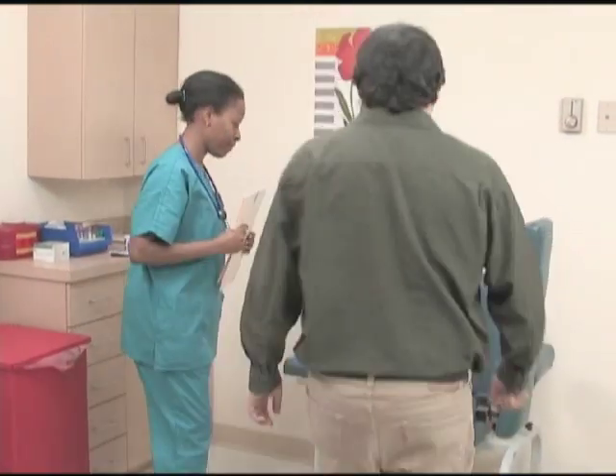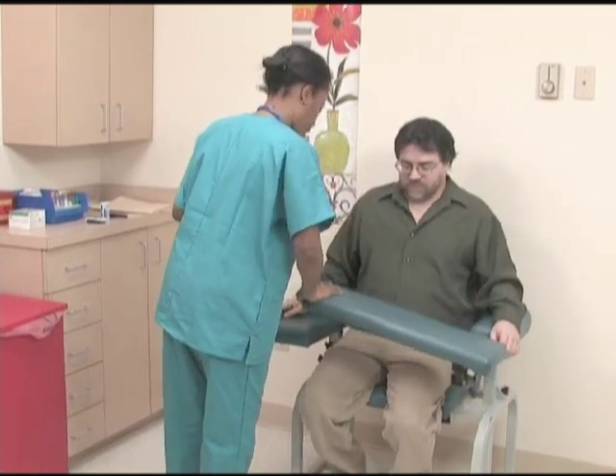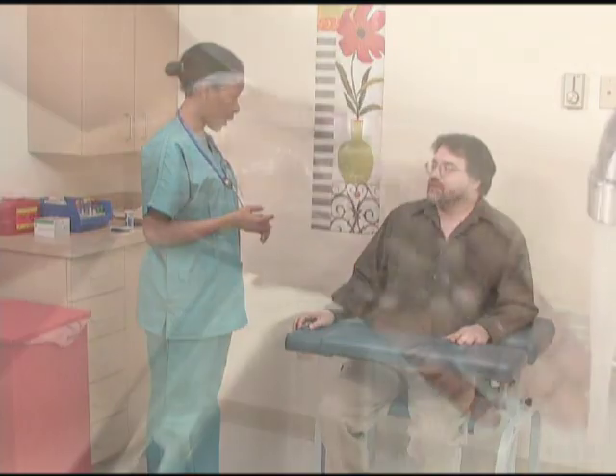Escort the patient to the laboratory draw area and confirm identity. Explain the procedure.